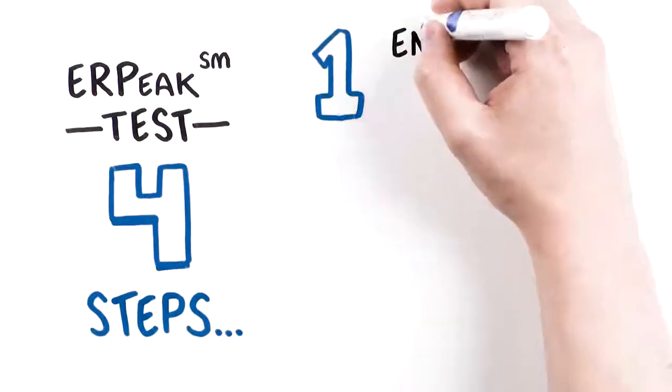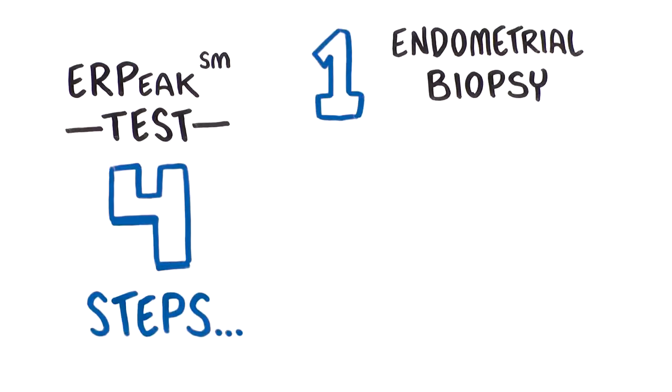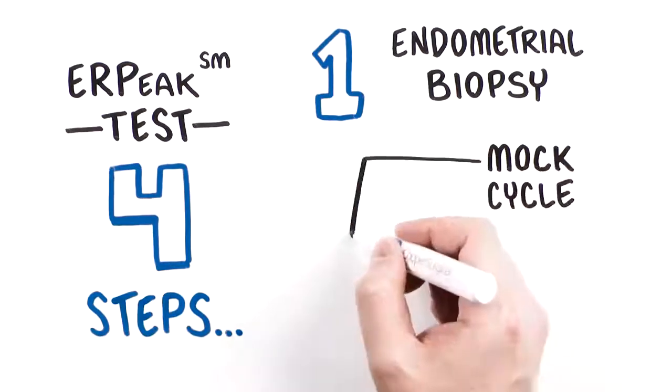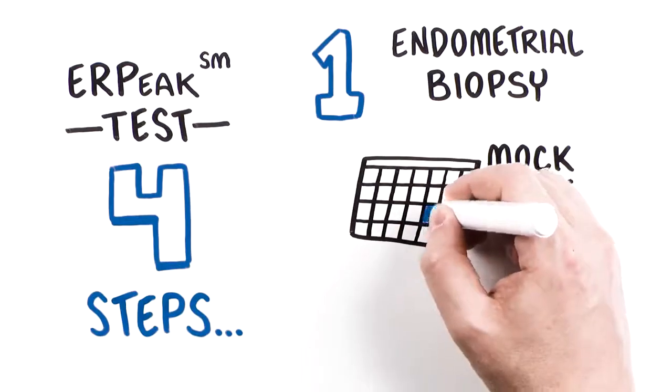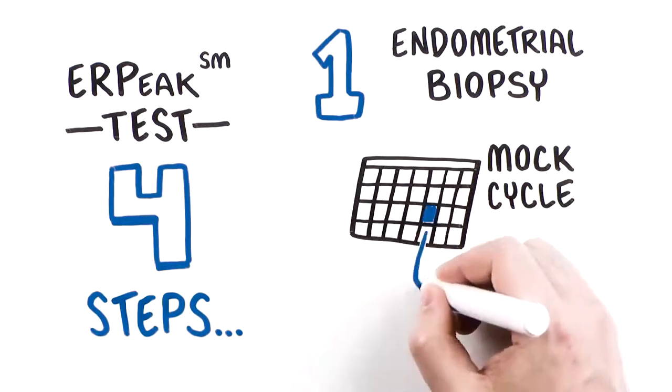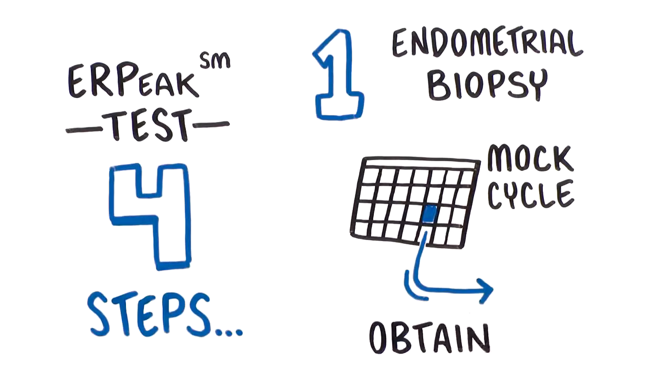Step 1 is to obtain an endometrial biopsy during a mock cycle. A mock cycle follows the same protocol used during an embryo transfer cycle, but rather than transferring an embryo, you will obtain an endometrial biopsy.